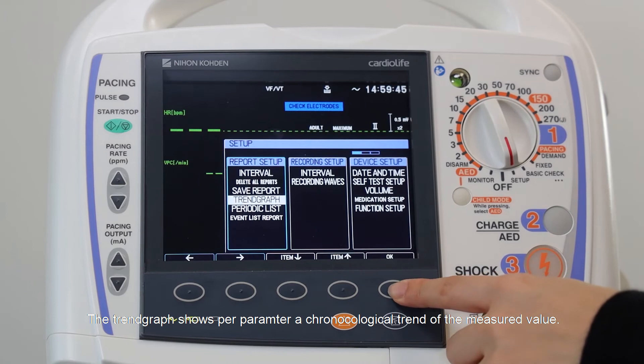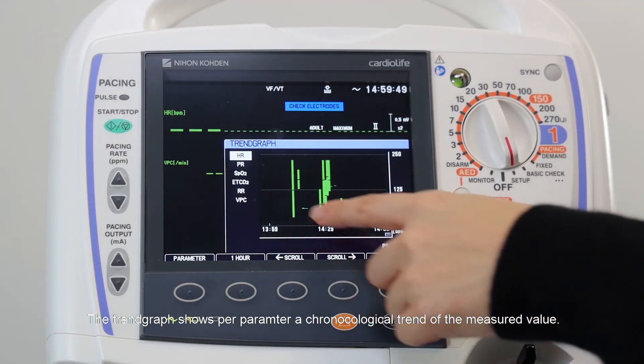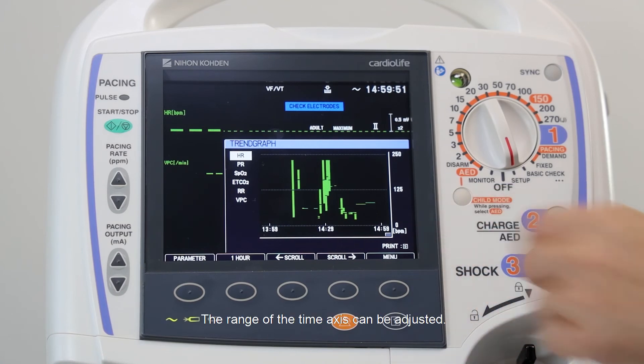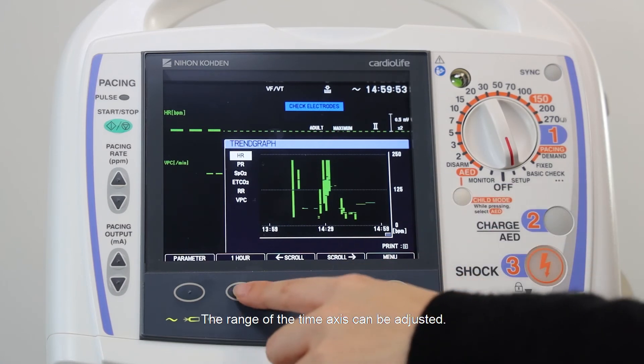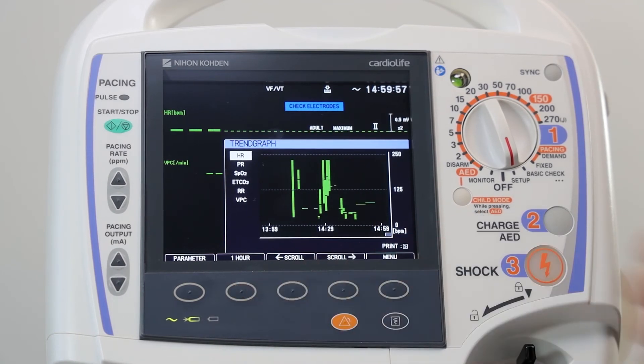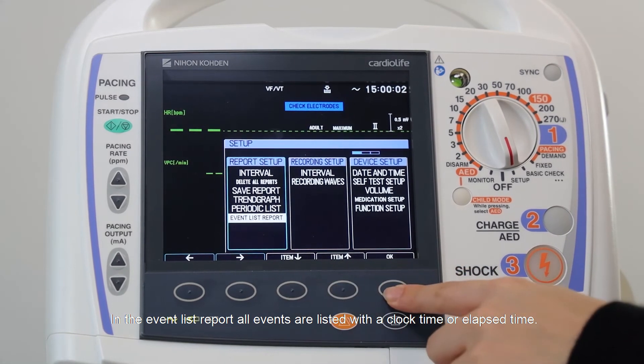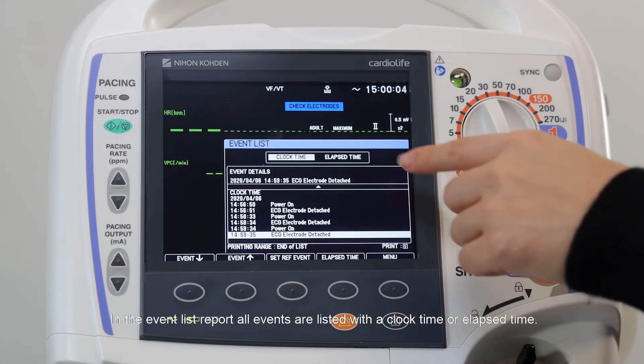The trend graph shows, per parameter, a chronological trend of the measured value. The range of the time axis can be adjusted. In the event list report, all events are listed with the clock time or elapsed time.